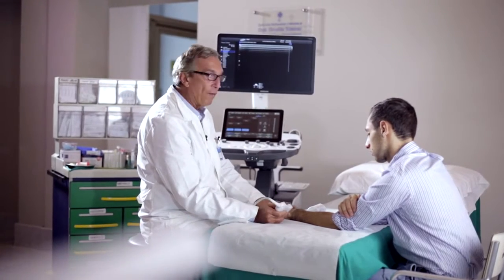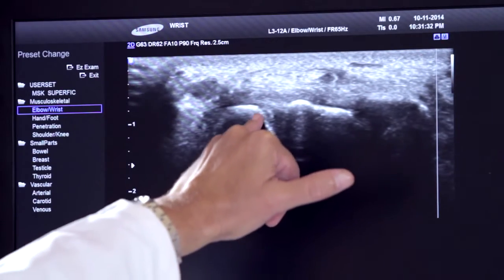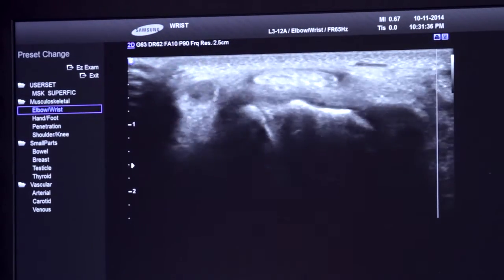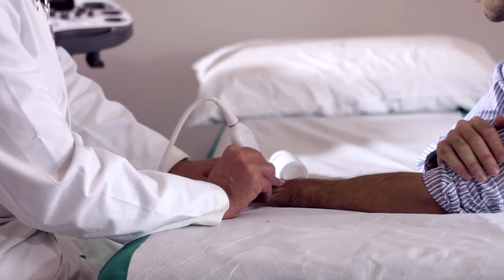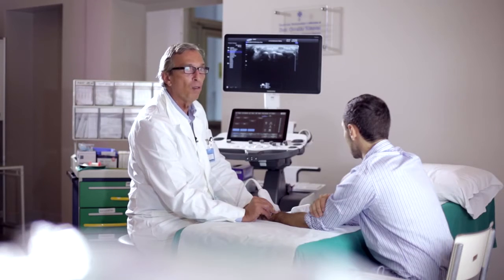The dorsal scans are also crucial to see the small ligament of the wrist, which is the scapholunate ligament. This ligament connects the navicular with the semilunate carpal bone. This is a dedicated scan in which we can clearly see this very thin ligament in the dorsal part of the scapholunate complex that runs right between the scaphoid to the left and the semilunate to the right. We can also perform dynamic maneuvers to establish any laxity or laceration of this ligament, which is very important for the stability of the wrist.